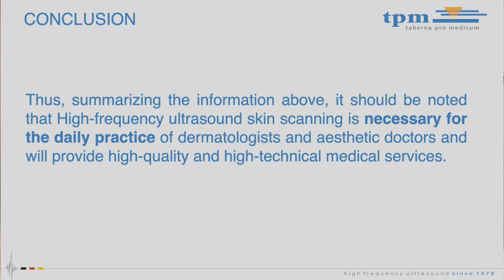So, dear colleagues, as we could see today, high-frequency ultrasound is a comprehensive system for complete skin examination. The universality of the system is that it allows to visualize the skin from above using dermoscopy and examine all the changes inside the thickness in all layers.